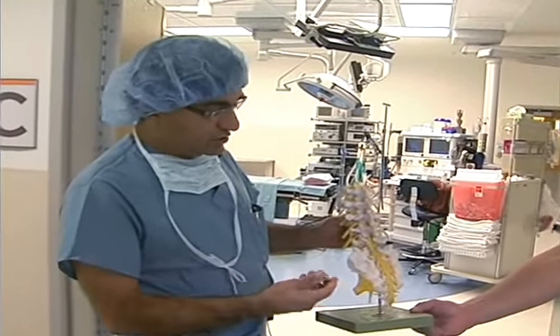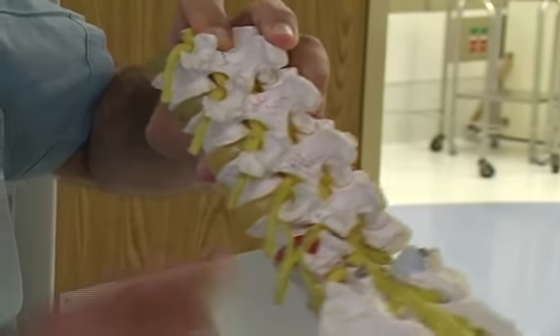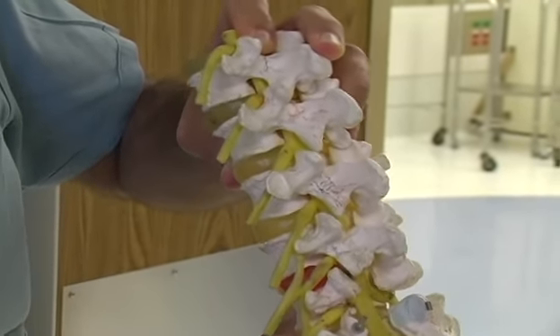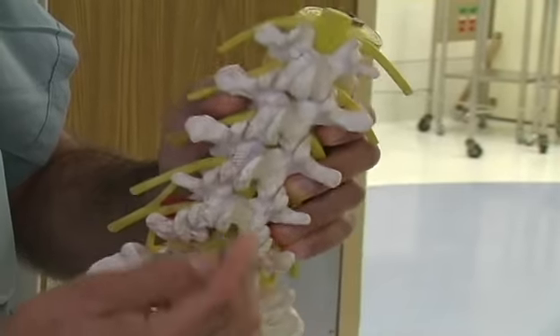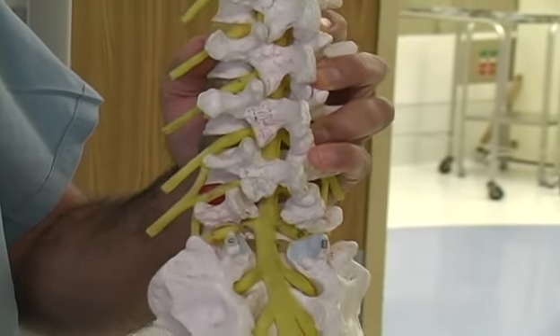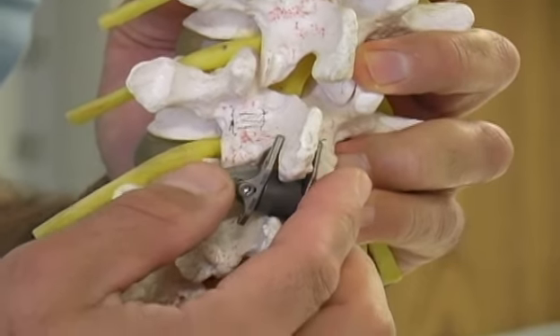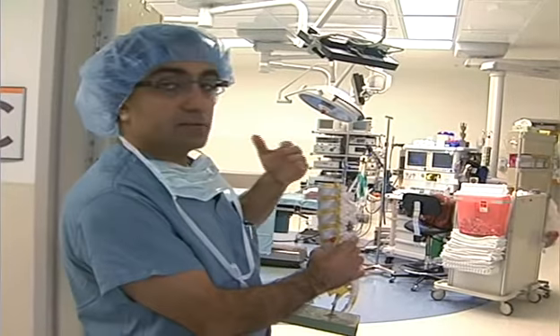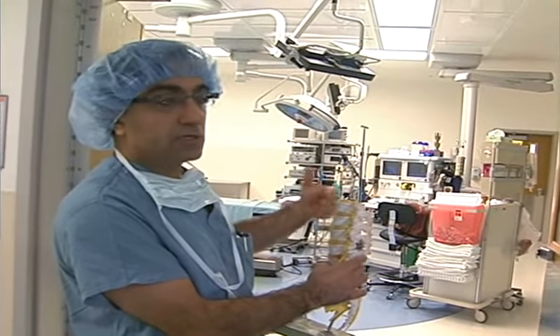What patients typically do is when they're flexed, when they're hunched forward on shopping carts, they actually open up the canal and actually unpinch the nerves. So they're indirectly getting relief by unpinching the nerves, stooping and bending forwards. With this novel procedure, which is called XSTOP, you actually get the same results, except the way the procedure is done is you bend the patients forward in the operating room, and then you insert this device that fits right in between the two bones. With that, it actually locks that spine in an open position and prevents any compression of the nerves. So when one stands up, that person can actually stand up straight without pinching off the nerves. So they don't have to be stooped forward or hunched forward to get the relief.